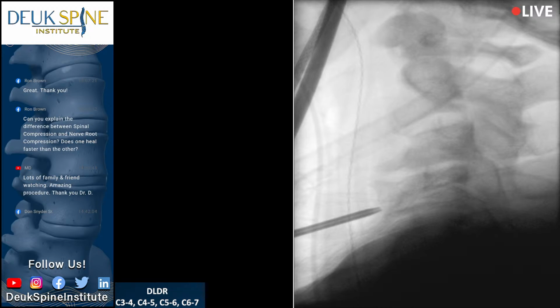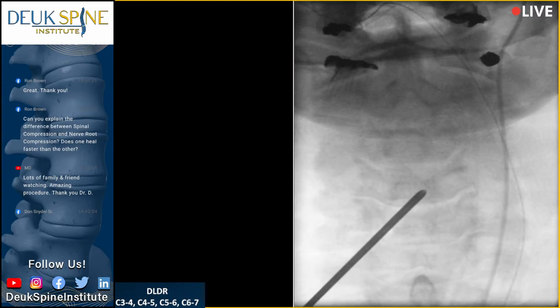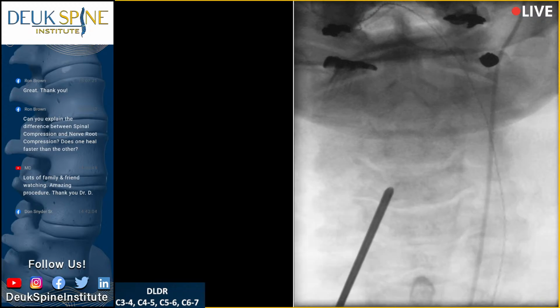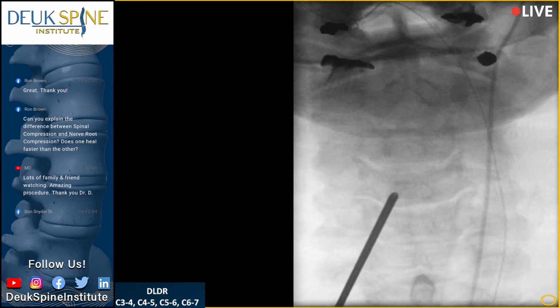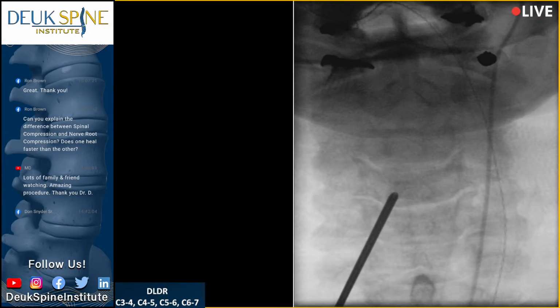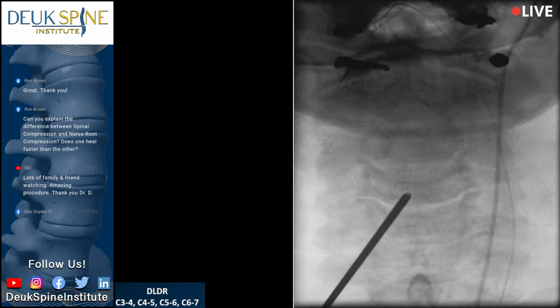Stay there for a second. Shot? All right, that's pretty good. Stay there for a second. It's just sliding. Shot? That's a little too much. Shot? Can you get me centered there? Are you centered? It's close. Try to get me the best center. The other way, maybe? Can you darken up the spinous processes? I see the spinous process. Stay there for a second. Shot. That's better. That's a little too much. Shot. Lateral. Perfect. Lateral.